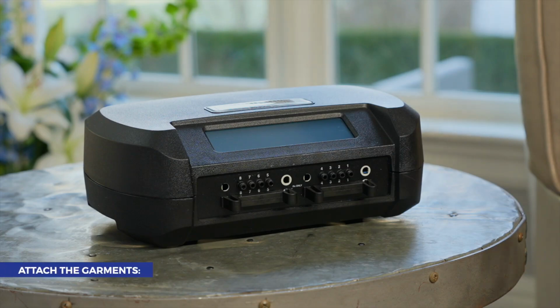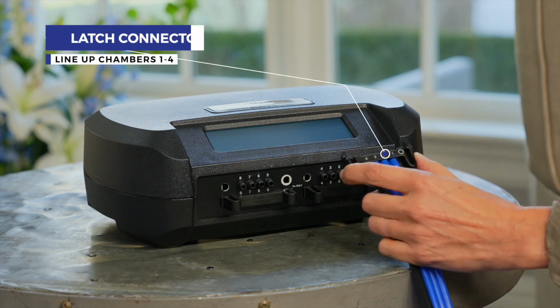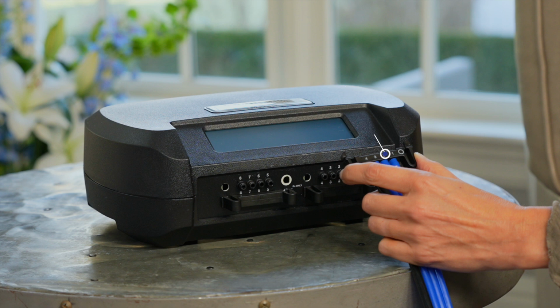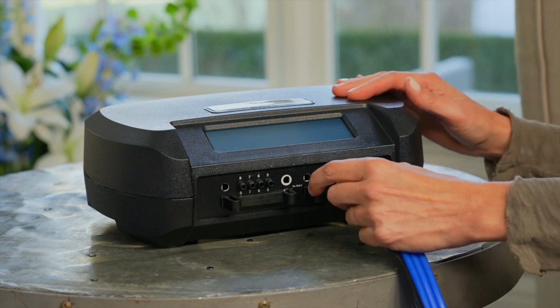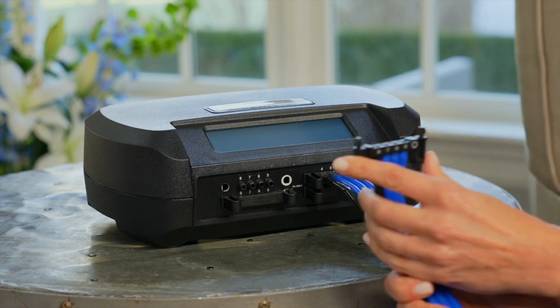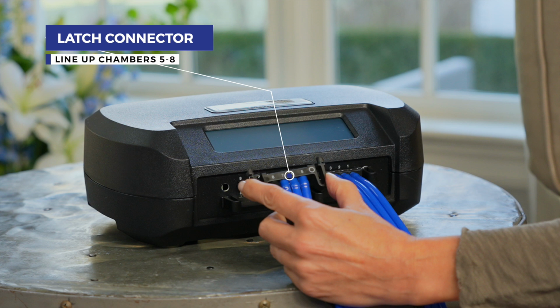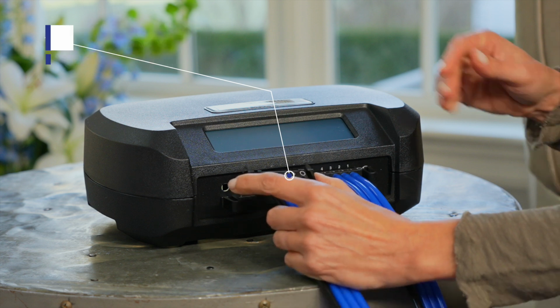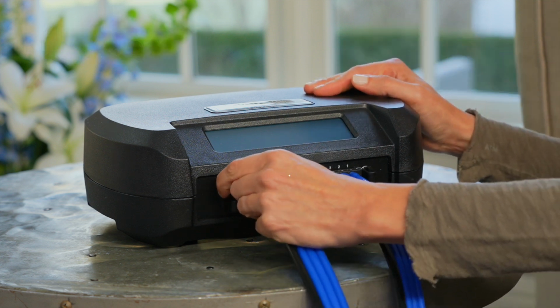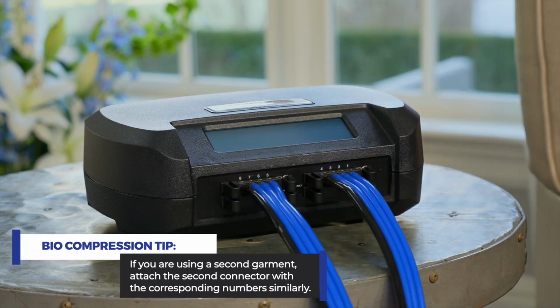The Quick Connect system makes it easy to connect tubes from your garments to the pump. Line up the chamber numbers 1 through 4 on the latch connector with the corresponding numbers on the pump. With the numbers facing up, squeeze the clip and insert into the port. It's that easy. Then line up the second latch connector 5 through 8 and attach the same way. If you are using a second garment, attach the second latch connectors in the same way.